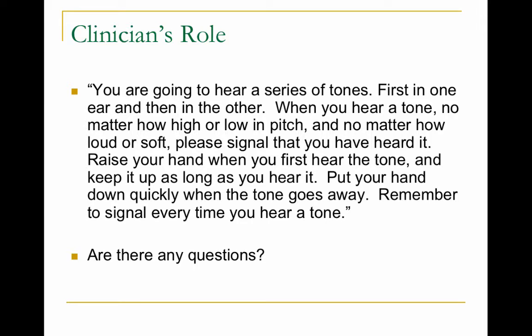Here's something that you could say, recommended by ASHA. You're going to hear a series of tones, first in one ear, then in the other ear. When you hear a tone, no matter how high or low in pitch, no matter how loud or how soft, please signal that you heard it. Raise your hand when you first hear the tone and keep it up for as long as you hear the tone. Put your hand down quickly when the tone goes away, and remember to signal every time you hear a tone. Do you have any questions?